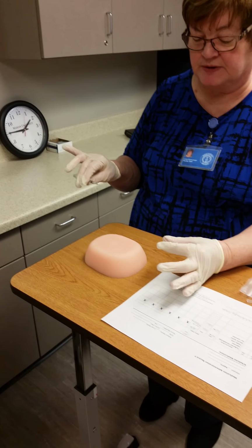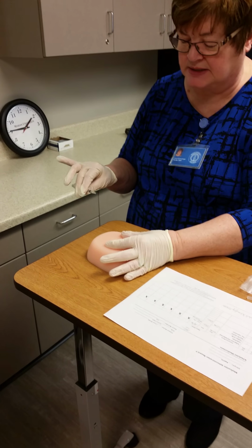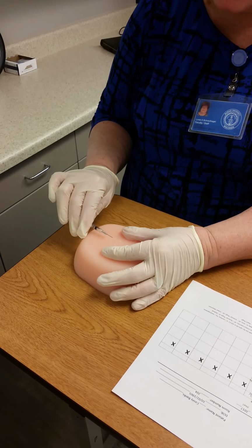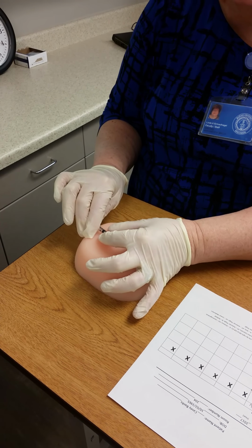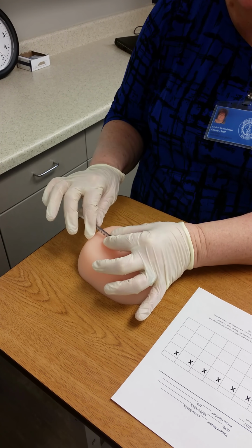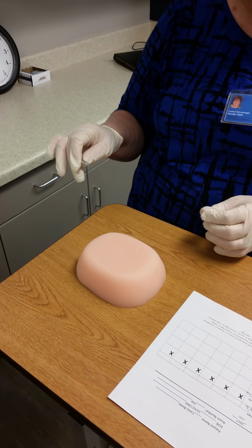You're going to come in with your fingers a little bit wide like this into the site where you determine you're going to insert that needle, and then pull the skin taut. You're going to come down, bevel up, insert at a 5 to 15 degree angle, 1/8 of an inch, grab your needle, and then push your fluid in. Wait a second or two, and then remove your needle and pull away. That's one way that we like to see you do it.